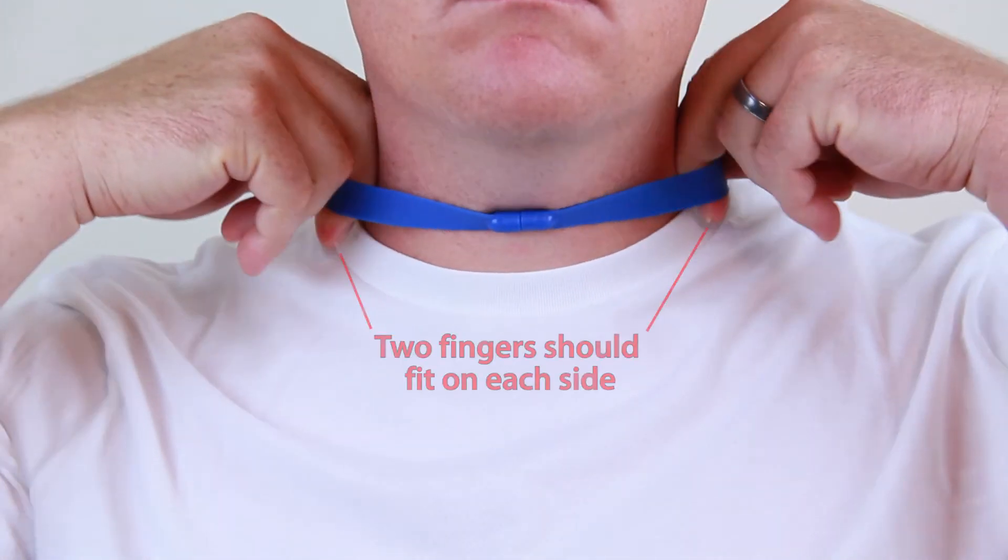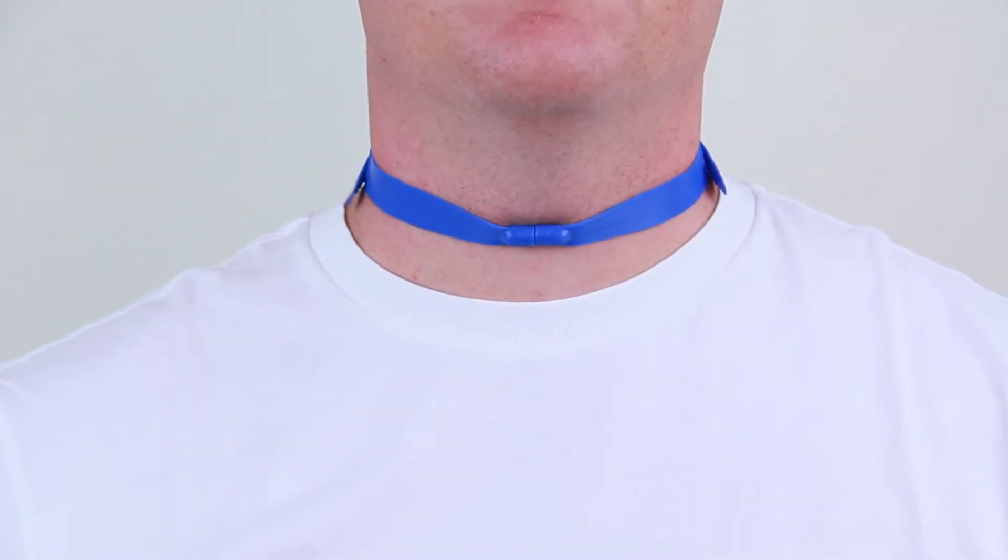If adjusted properly, two fingers should fit between the strap and the neck on each side without causing the magnetic clasp to release.